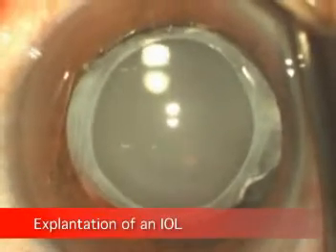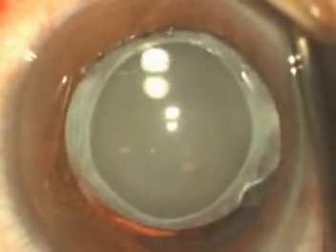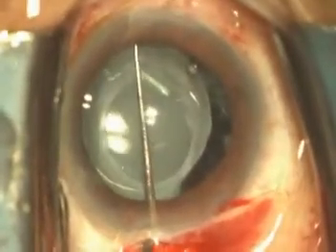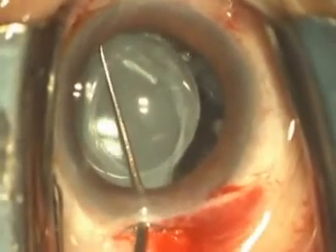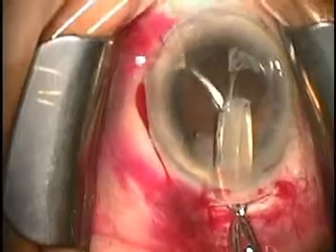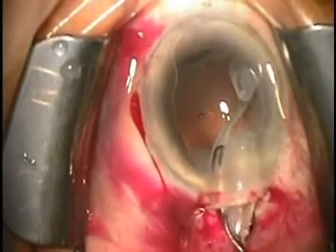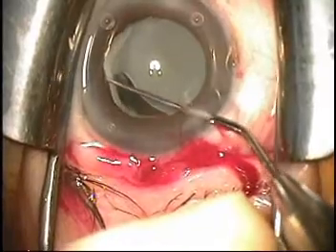The intraocular mirror can be used for successful explantation of an opacified intraocular lens. The key step is the release of adhesion between both haptics and the capsular bag without damaging the zonule. If the surgeon cannot determine the position of the haptics, a zonular break is likely to occur. The intraocular mirror shows where one haptic lies, so it can easily be separated from the capsular bag by using an instrument.